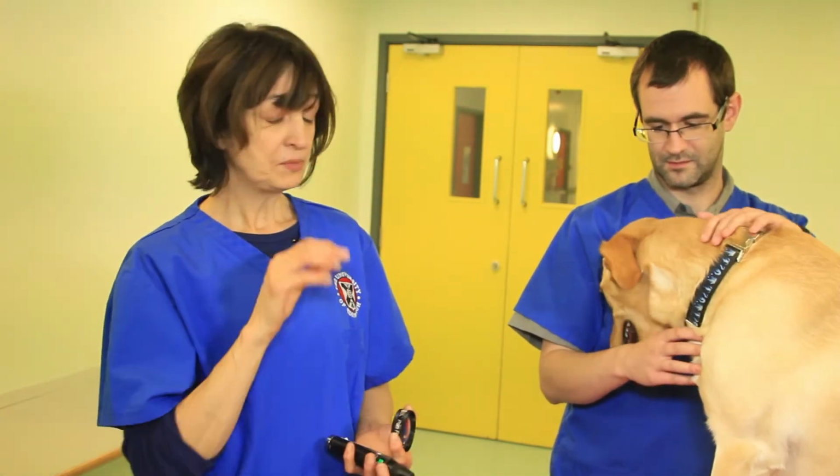So your requirements to perform indirect ophthalmoscopy are a patient with a dilated pupil, a dark room, a condensing lens, and a focal light source. The patient should be directly looking at you. You want to imagine that there's two steel wires coming from the middle of your pupils to the middle of your patient's pupils, so you're absolutely eyeballing them.